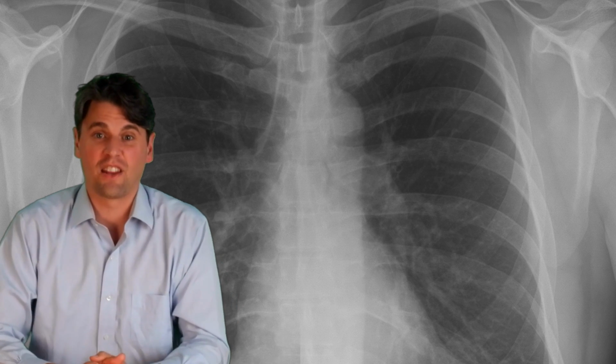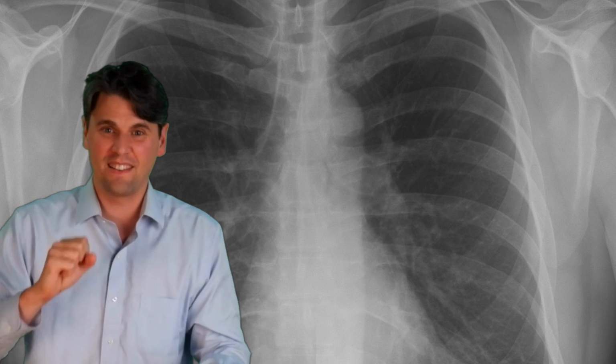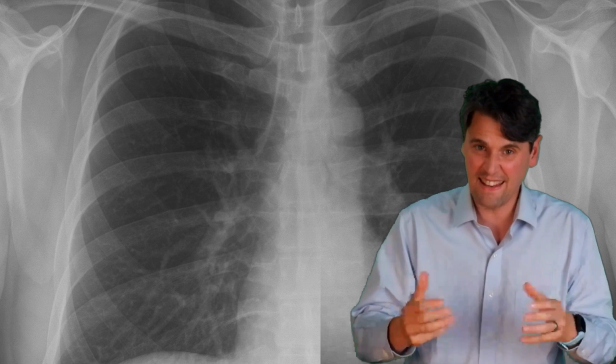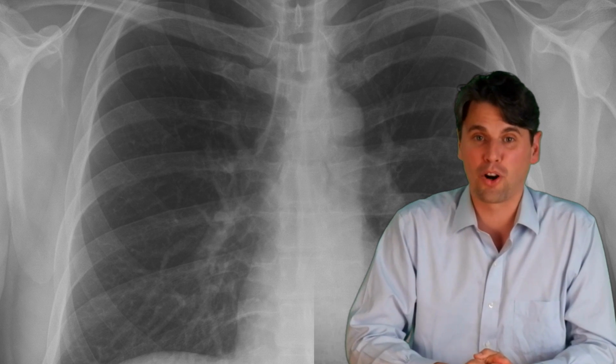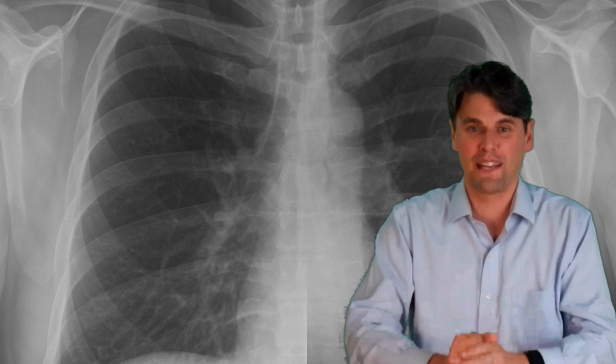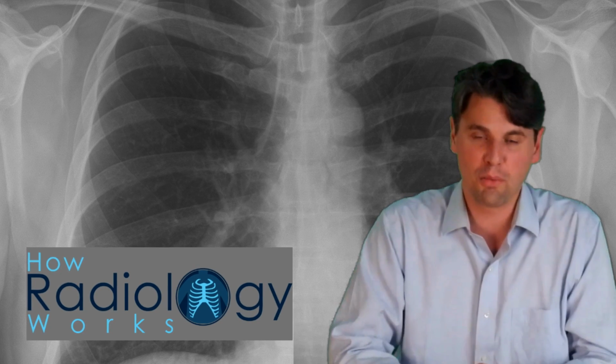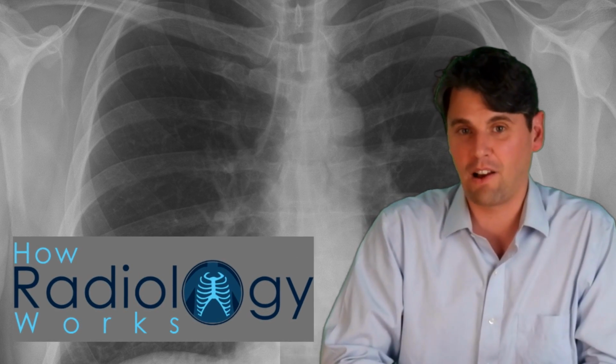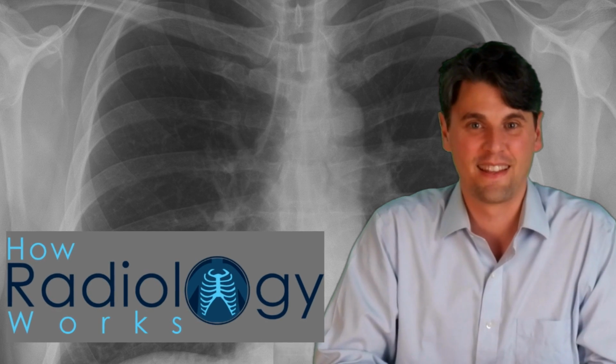All right, Red Nation. Today we're going to be talking about photon counting CT detectors. They're going to have to count pretty high though. We're often talking about 10 to the ninth counts per detector cell per readout on our CT detectors. Again, that's what makes CT so much more challenging than a modality like PET, where they've been using photon counting detectors for some time. I'll quickly go through scintillation-based detectors.